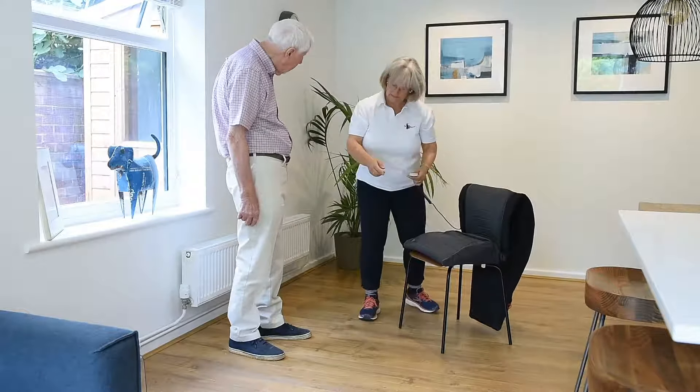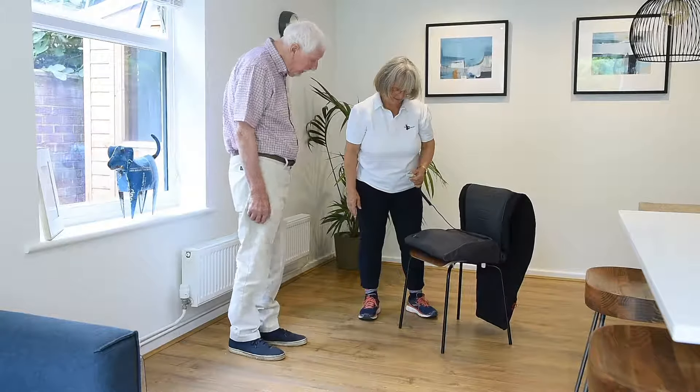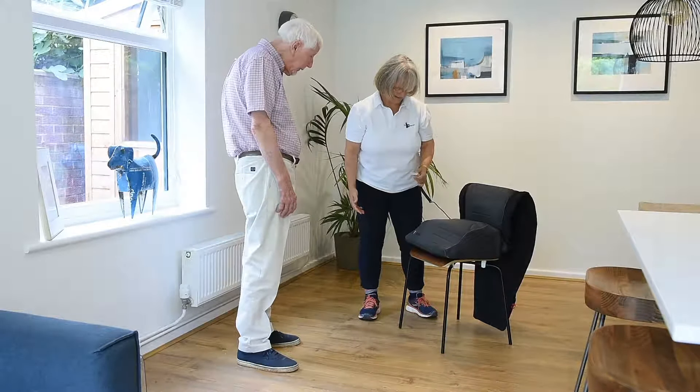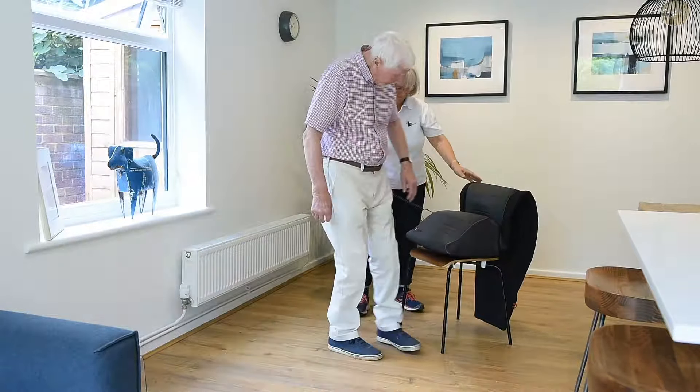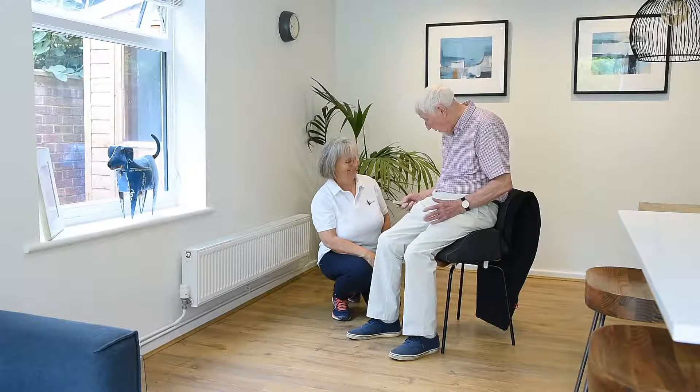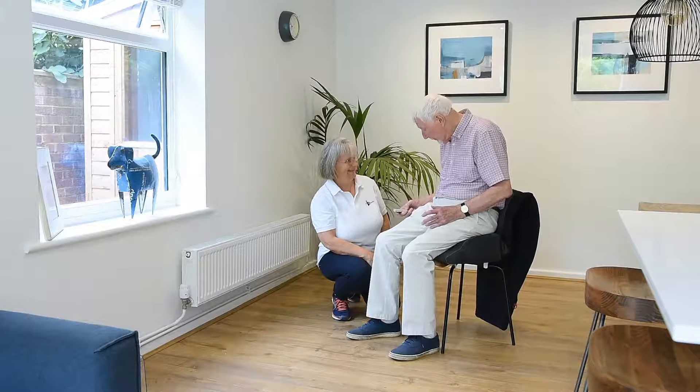The SitnStand Smart portable rising seat can be fitted onto most chairs. It has four cells that inflate and deflate one at a time, controlled by the client using a simple, intuitive hand control.